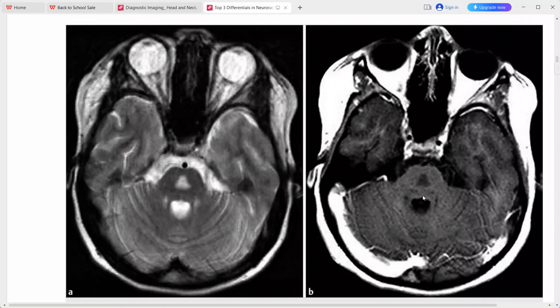Considering this focal pontine signal abnormality — centrally placed, triangular in shape, showing no enhancement in an adult patient — the top diagnosis is osmotic demyelination or central pontine myelinolysis. This is a very typical imaging picture of central pontine myelinolysis.